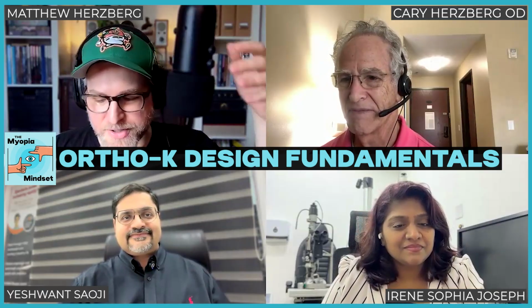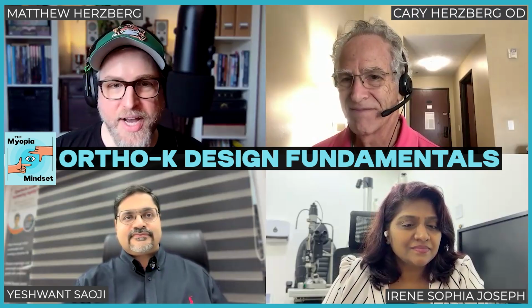All right, so let's get to the questions that I've been taking notes on over the course of the episode for the panel here. So I want to go back to diameter, which was the very first thing we talked about. Why diameter? Because in the practices I've been in and the consulting I did with J&J, where I would go into a practice and fit a lens, 9 times out of 10, if there was a problem, it was the diameter. The culprit was incorrect HVID measurement. That's where it all started.